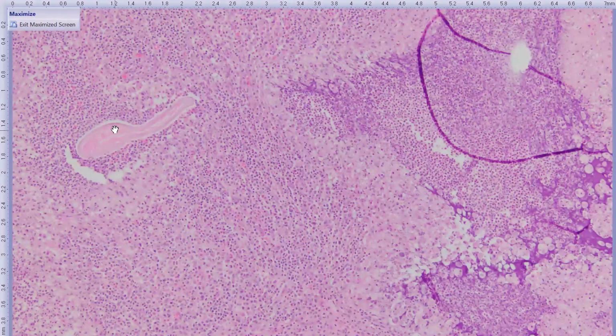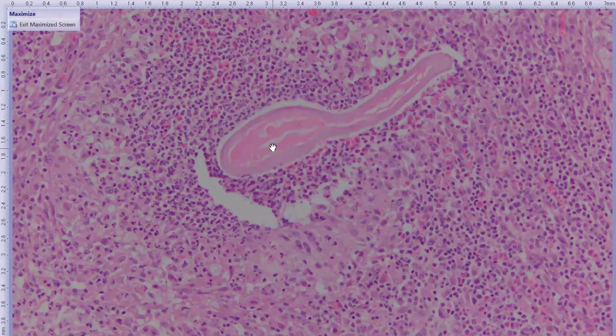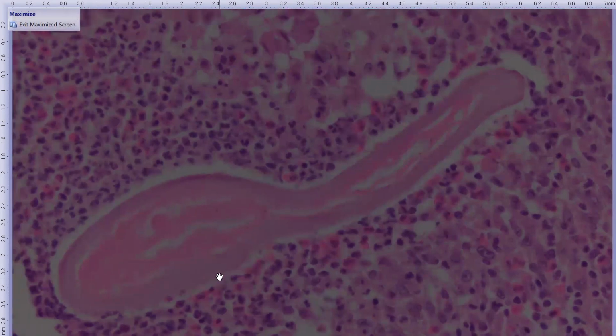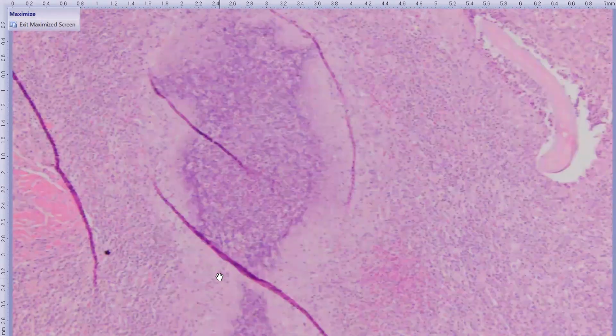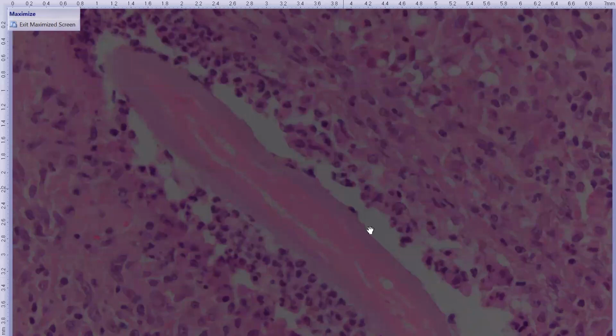And in the center of some of these inflammatory nodules, there are some nematode parasites. The ones that are sampled are fairly degenerate. I think they're not viable anymore, which is probably why there's so much inflammation around them. But if you look really carefully, and I guess I could go higher mag, there are little nubbins poking off the cuticle of this nematode parasite. And there was another one over here. Maybe its nubbins are more, maybe they're not that much more obvious, but anyway.